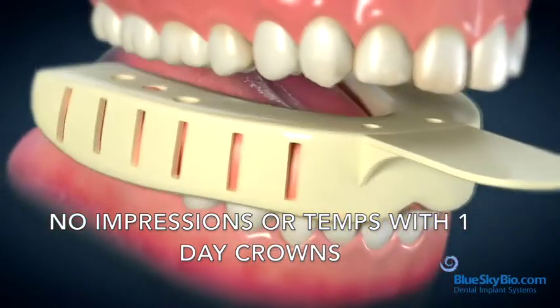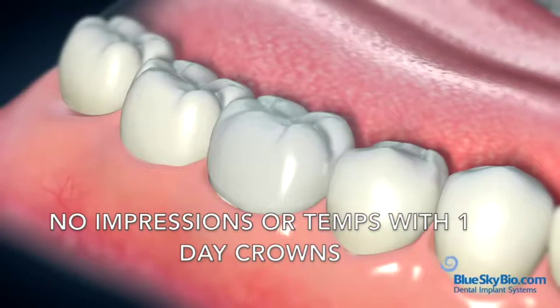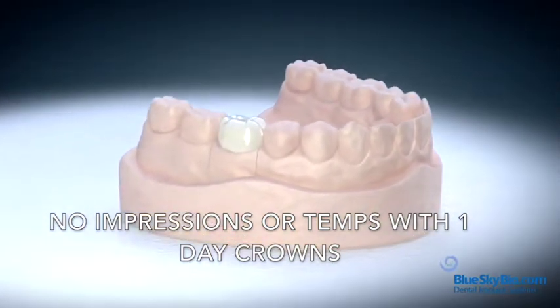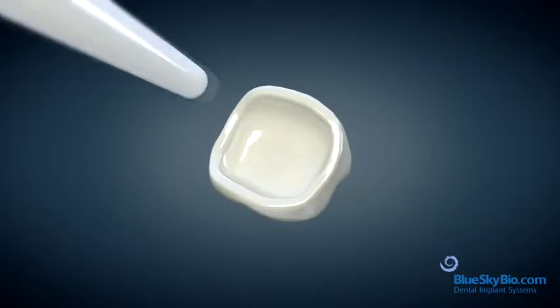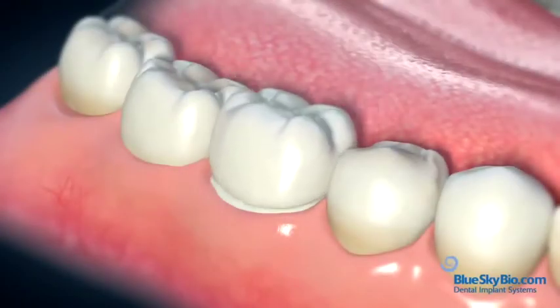A mold of the tooth will be taken and a temporary crown is placed to guard the prep tooth. The mold is sent to a dental laboratory where a customized crown is made just for you. Once the dental office receives your crown from the lab, you will be appointed to have your crown delivered. If you are satisfied with the shape, color, and fit, the crown will be permanently cemented on your second visit.